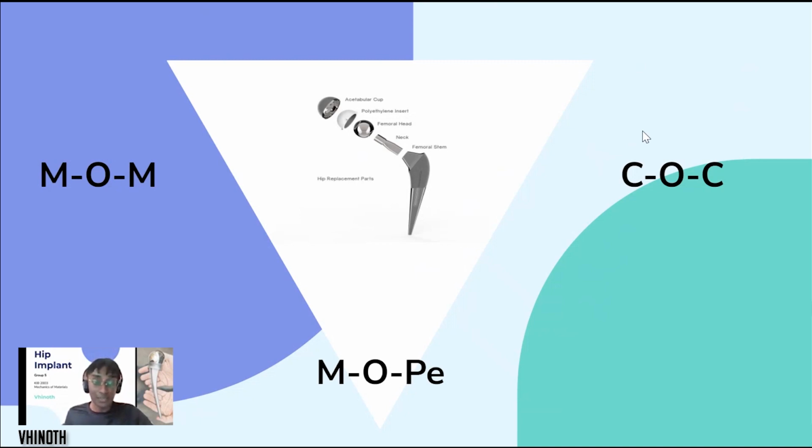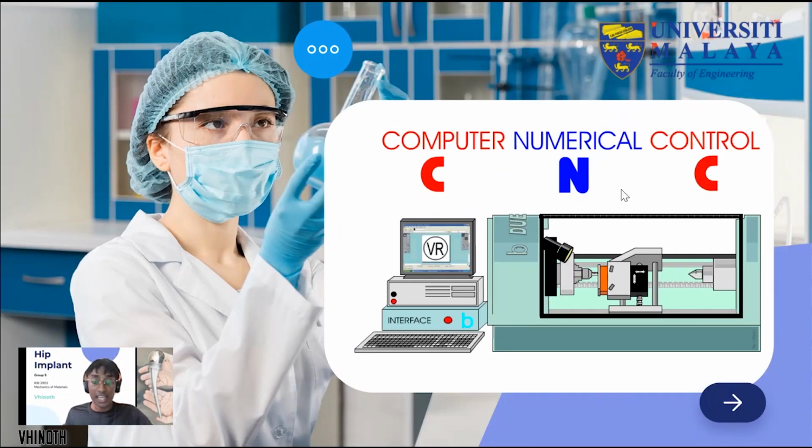C on C is highly suitable in younger patients due to its hardness and less wearing properties. The cons of this implant occur when there is a fracture formation, which devastatingly results in third body wear. Thus, in order to reduce the current errors in design and manufacturing, new methods such as introducing pits or doing surface texturing can be done.